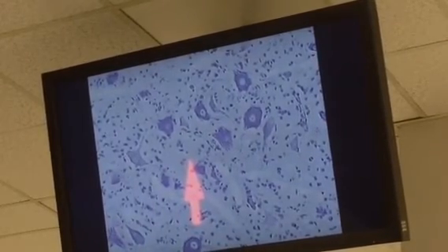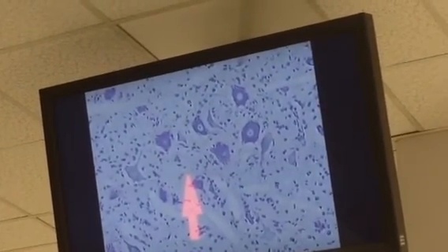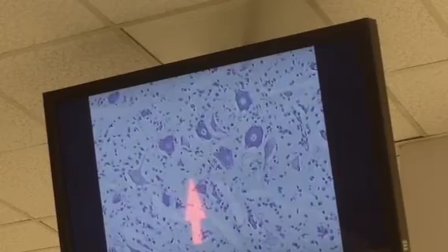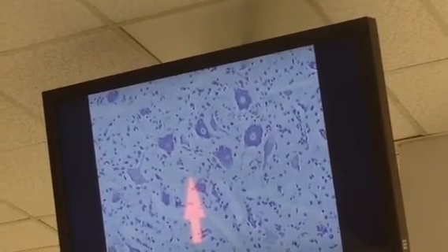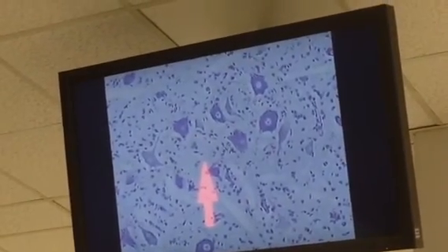So all those axons and dendrites and synapses are being unstained in this section. And that's why most of it looks white. Unstained axons, dendrites, and synapses. The generic name we have for that compartment is neuropil.